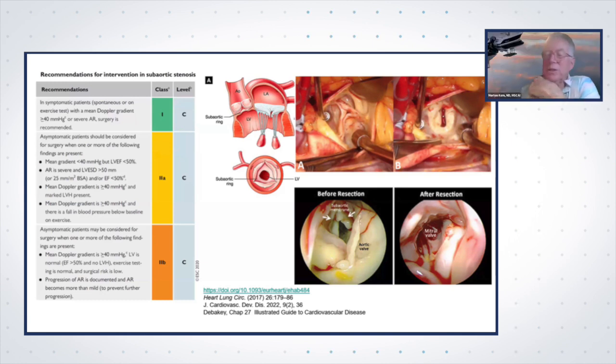You know, Arnold, you mentioned the waveform of the LV or clues that this may be something different. I think that LV waveform that was finally obtained with the single lumen is peculiar for an AS patient. So it's clearly not AS. It's more HOCM-like in some ways, but I don't think it's dynamic.